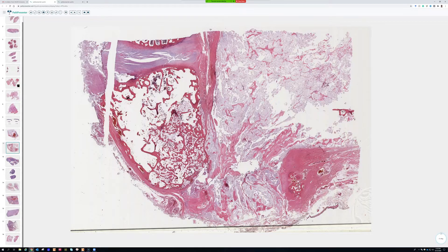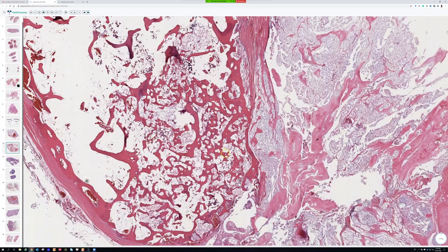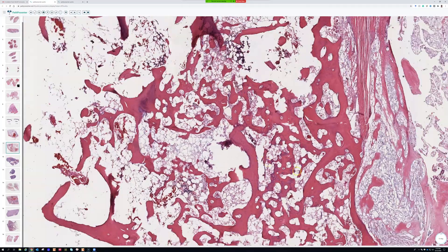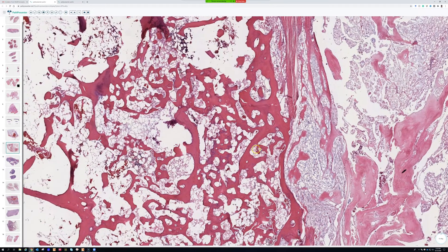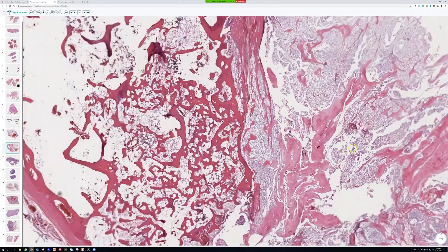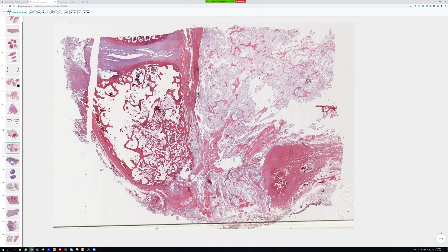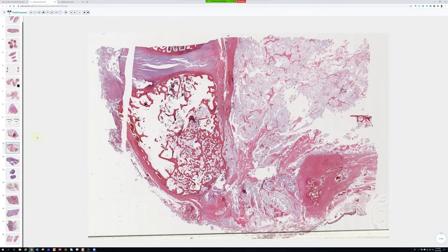It's actually at the very tip of the sacrum — the coccyx. Isn't that an amazing section? This is an anterior-posterior sagittal section right through the coccyx. You can see the very end of the coccyx and the fibrocartilage of the disc — just fascinating. You can see that the tumor is emanating from around here, growing into the bone, with tumor visible within the bone itself and then forming a large mass out here in the soft tissue. Truly one of the most amazing sections in my collection.